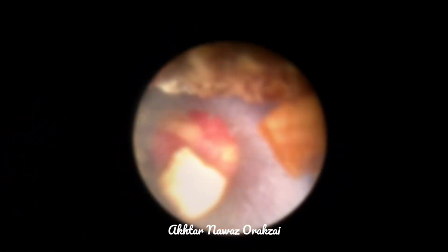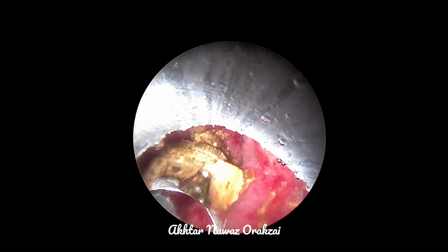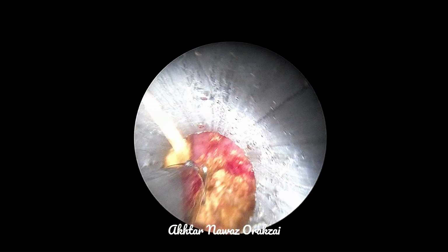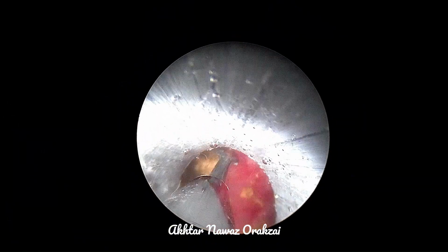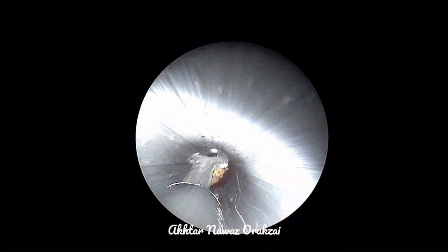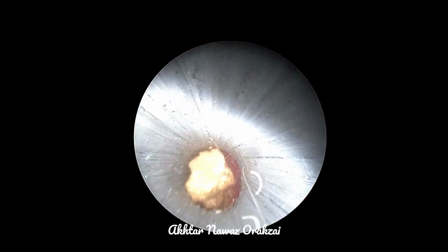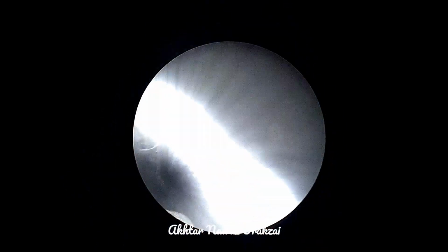So in the percutaneous suprapubic route, we place a 2-way or a 3-way catheter for 1 or 2 days, just in case there is blockage of the perurethral catheter and there is leak in the suprapubic region. So this catheter is a good way. It's not necessary, but it's good to keep this place intubated.